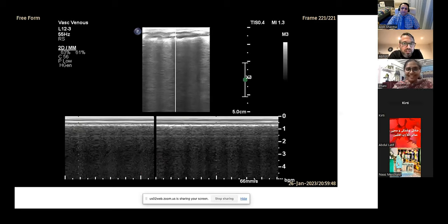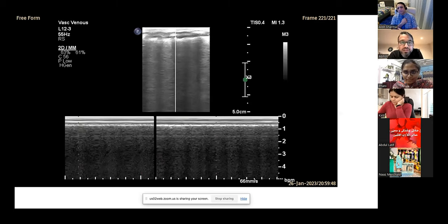That's number one. 5 centimeter of depth is fine, but for babies, 3 to 4 centimeters also does the thing. And you don't have a blackout area on the screen if you keep it at 3 to 4 centimeter. Here, we don't see any blackouts or any fallouts of the image, but sometimes you do get, in a situation like that.